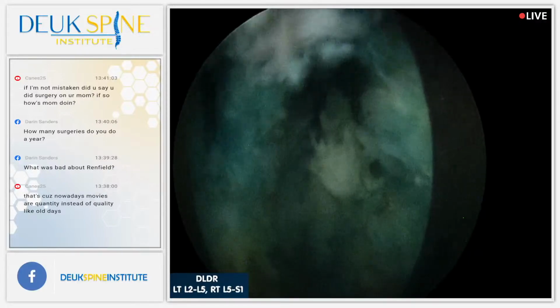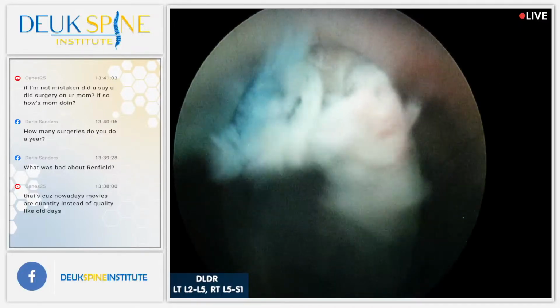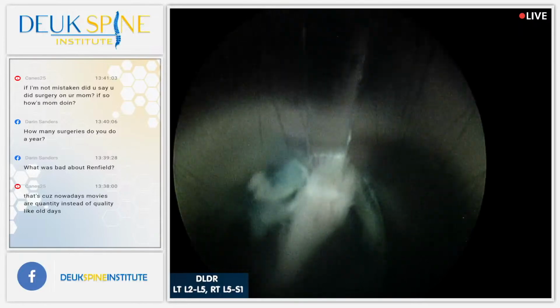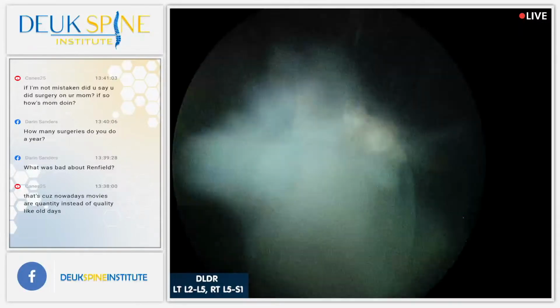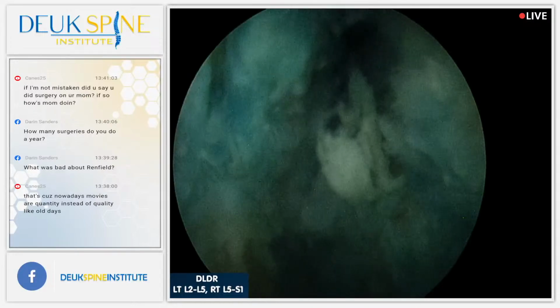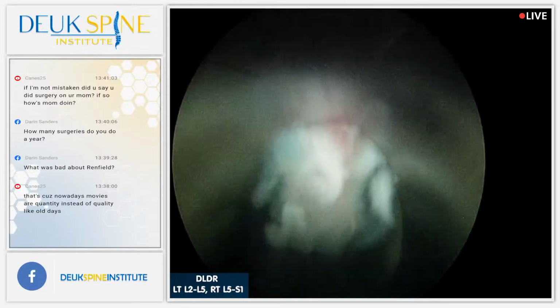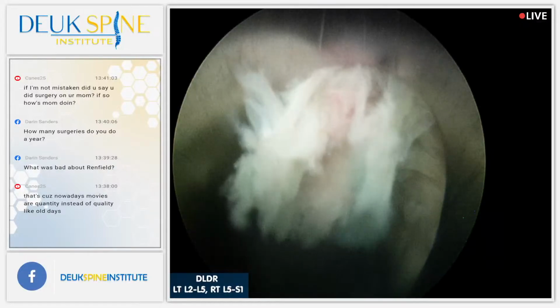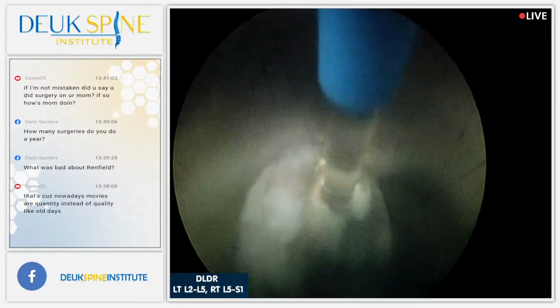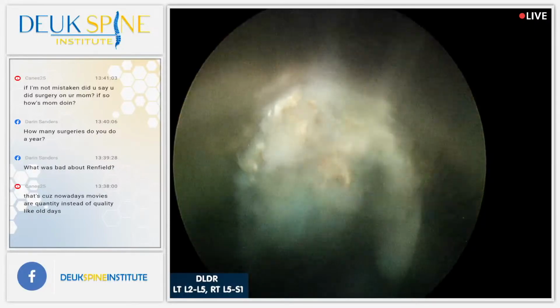All right, I'm going to pull back a little bit. And you can see the tear right there in the annulus. And that's where his back pain's coming from. A little bit of inflammation there on that piece of white annulus. You can see the pink color, right? You guys all see that? Yes, we do. Pink, blue, and white. That's mostly what we see here. A little bit of orange when we hit some calcium deposits, some bone spurs, basically dystrophic calcification. But there's your tear. Look at that inflammatory tissue. You guys see it right there, huh? Henry, you got pretty good at seeing it. Yes, we do. It's in every single patient with back pain from a disc. You're going to have that pink stuff. It's just a matter of whether we see it clearly or not.